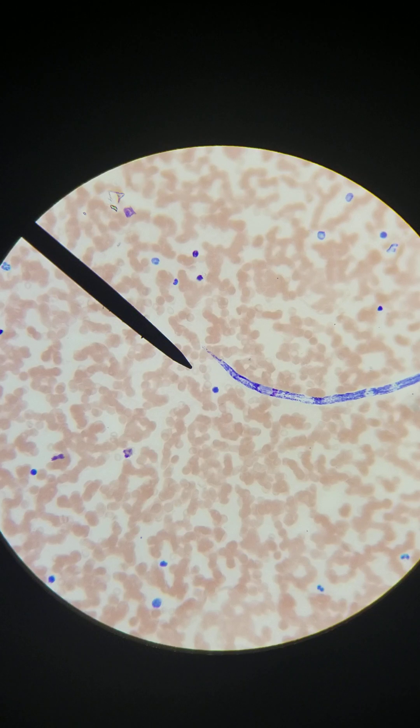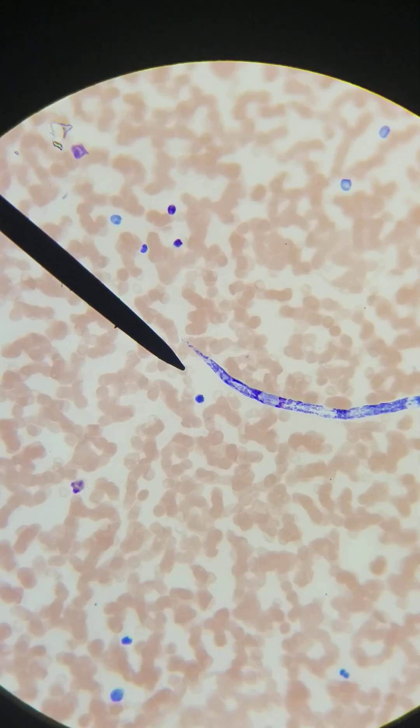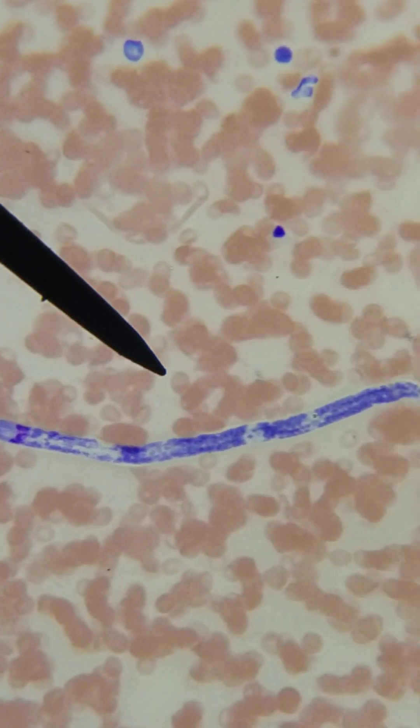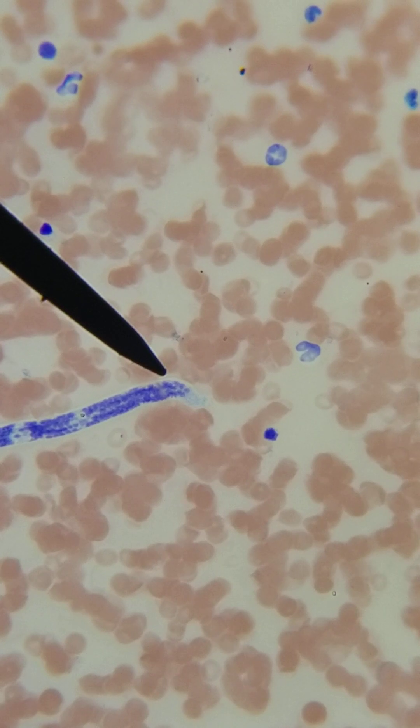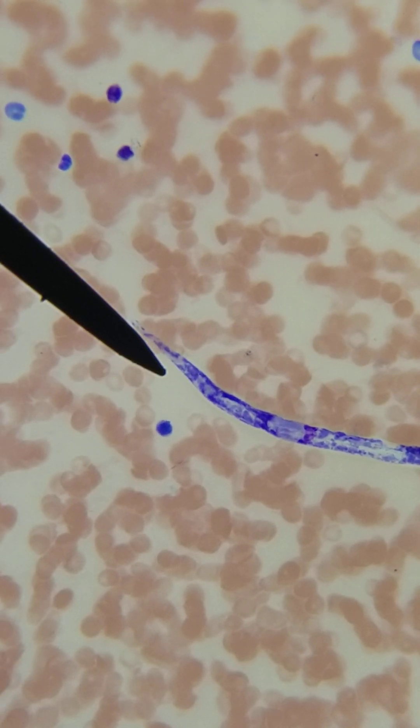Then we have the tip of the tail, which brings us to our next question: is there nuclei within the tail? Ours absolutely does look like it has nuclei to the tip of the tail. Does it extend to the tip? Yes, ours does. Is it in a continuous line? No, ours is not in a continuous line. Our sheathed microfilaria include a few different ones: Wuchereria bancrofti, Brugia malayi, and Loa loa. Loa loa is the African eye worm — there is an eye worm that can be seen from your eye and they have to pull it out.